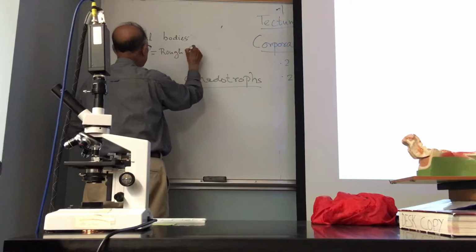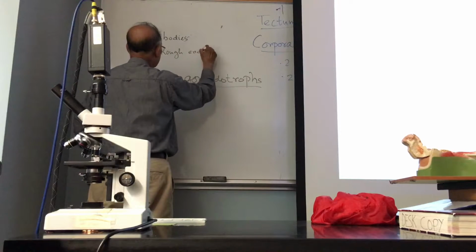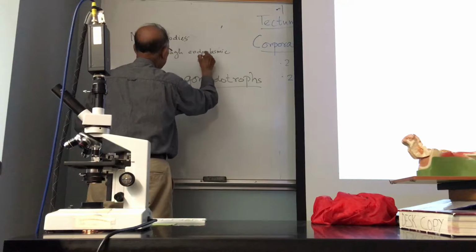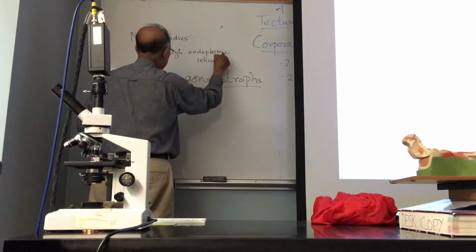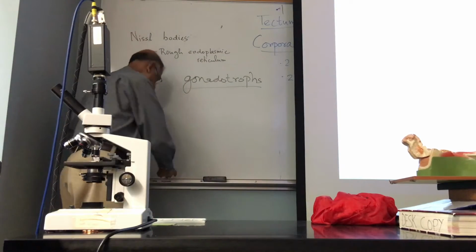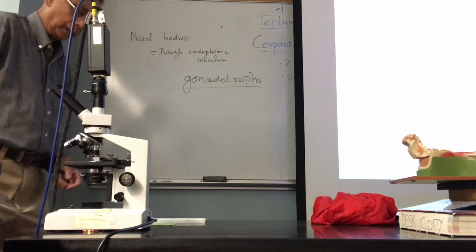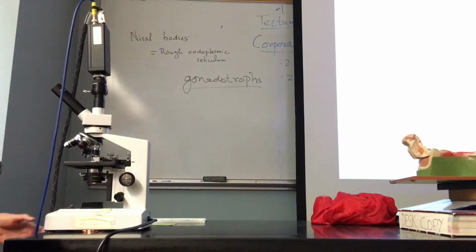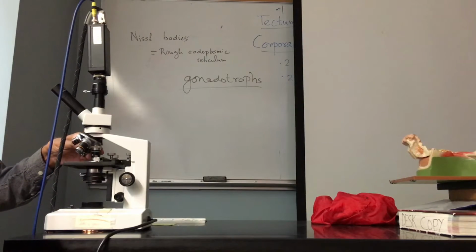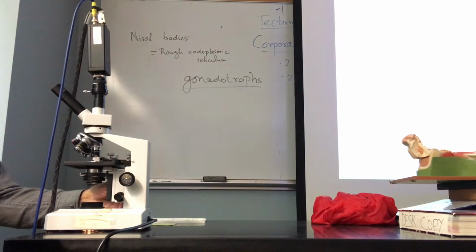Rough endoplasmic reticulum. So they will be much clearer when I magnify further, and you will see other features too. So we are going for the next magnification.